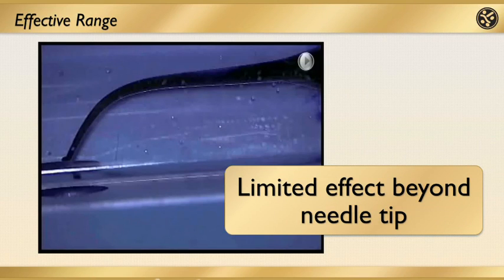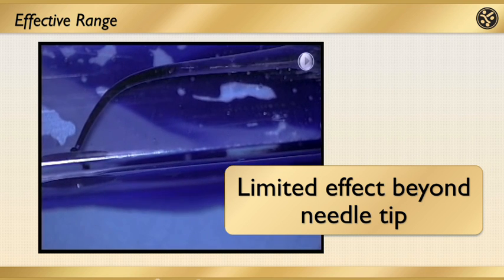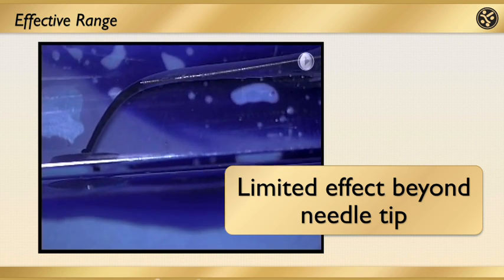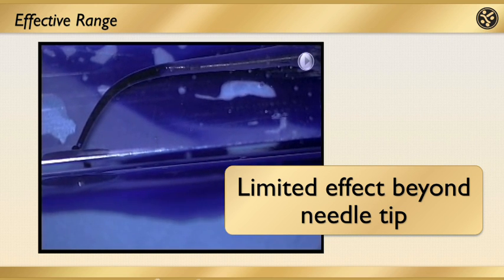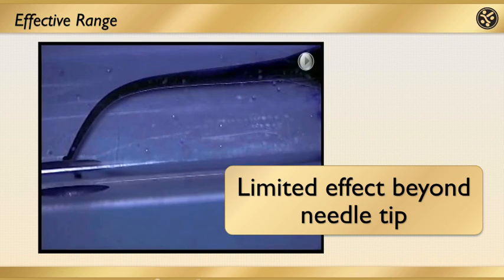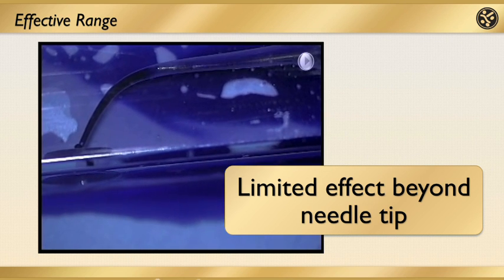And then I will know with the other lengths of the other canals that I will just take it to that length. This video that you're going to see will show a clear plastic block with blue dye in the canal space. When we start irrigating with our side vented needle, you will be able to see how the solution flows about a millimeter past the end of the needle. You can see now this take place, and you can see the effective range is only 1 to 2 millimeters past the end. This is why I have my assistant set the needle 2 millimeters short of the working length.